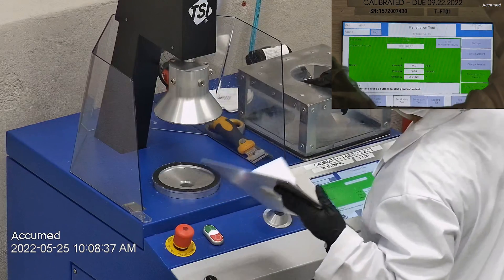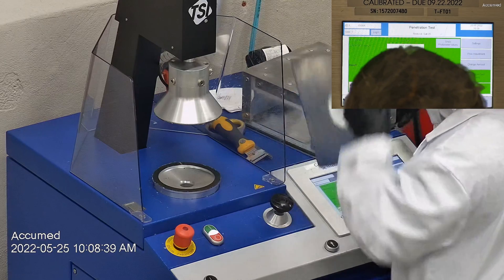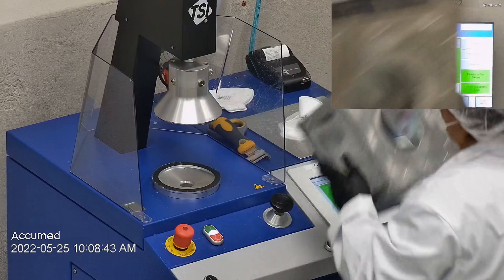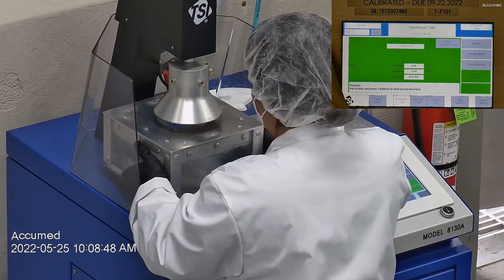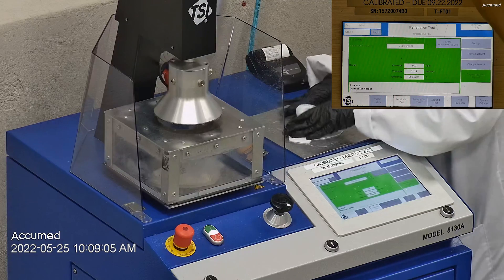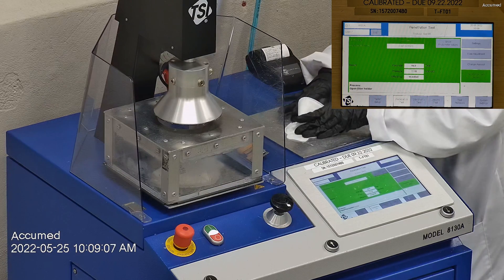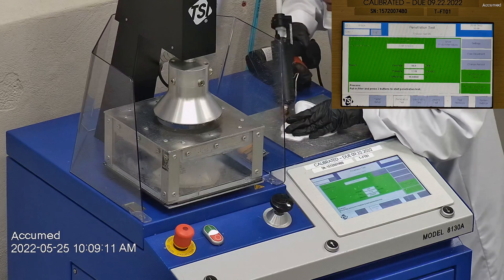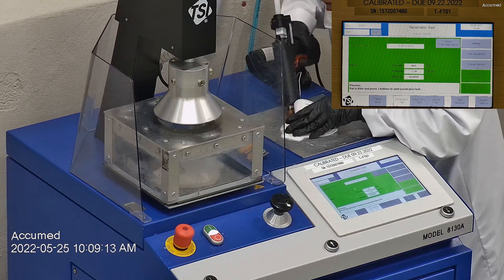The first sample tested at 98.91% filtration efficiency with a pressure drop of 10.6 millimeters of water. The second sample had a filtration percentage of 98.94% and a pressure drop of 11.1 millimeters of water.